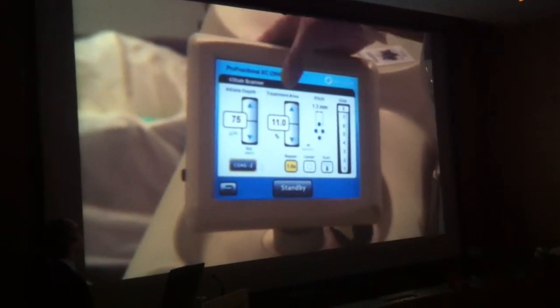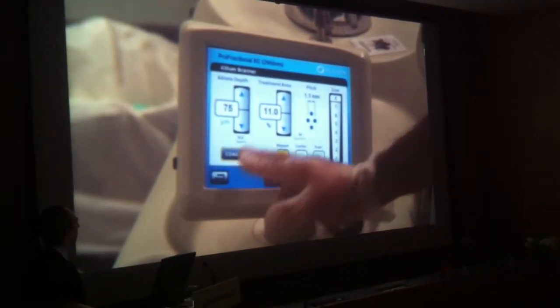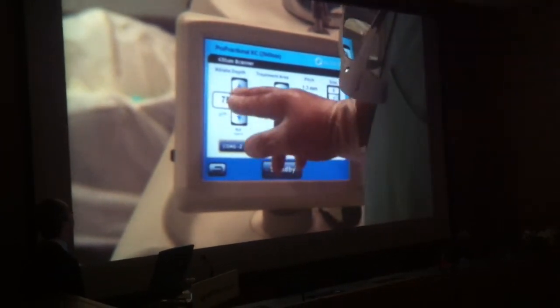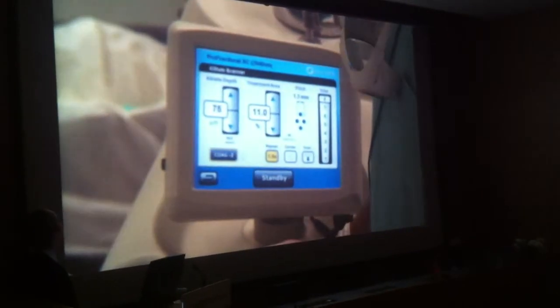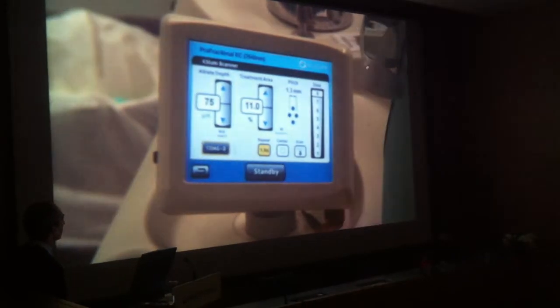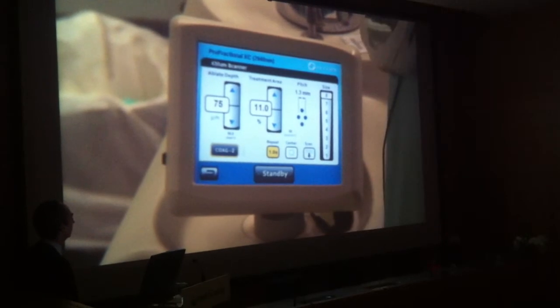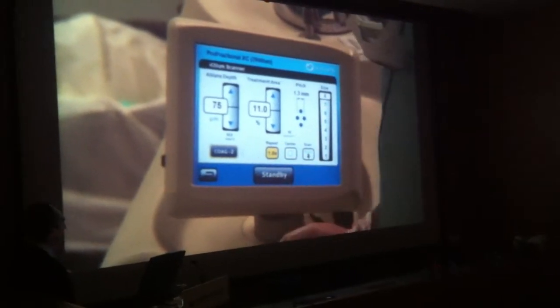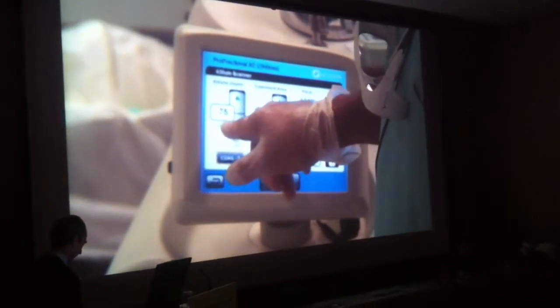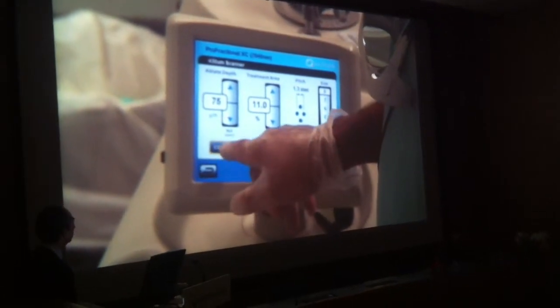you have a good correlation in the software between ablation depth, coagulation, and the density or coverage or treatment area. Now, this is obviously not exact. It can never be exact because the absorption of the skin changes from place to place, from patient to patient, and even in the same patient, different days, different hydration, and the absorption is going to be different. But what is important is that you have a good correlation here with your depth of ablation, and you can change also how much coagulation you want.